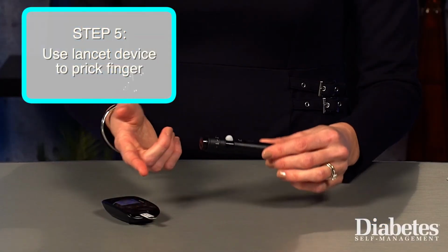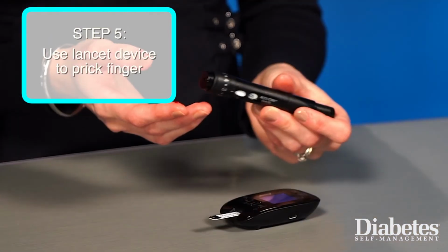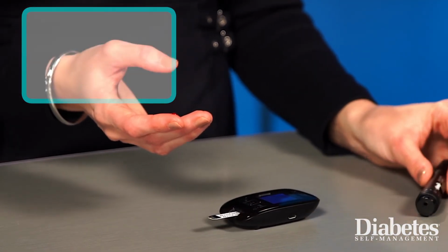Use the lancet device to prick 1 of your fingers. You can use any of your 10 fingers, or if your blood glucose meter is approved for alternate site testing, certain other areas of your body. If you are monitoring frequently, you'll likely want to rotate the sites where you are pricking your fingers.